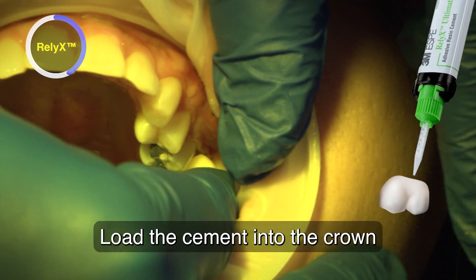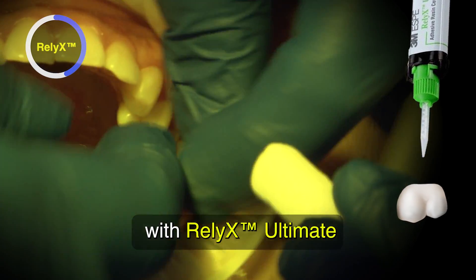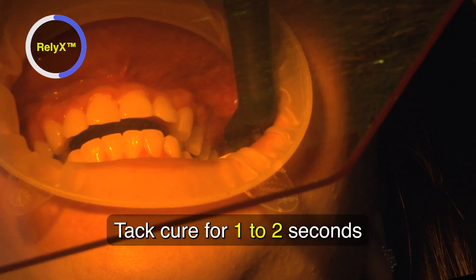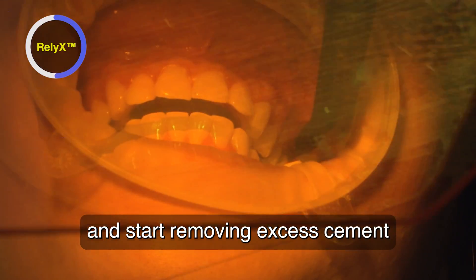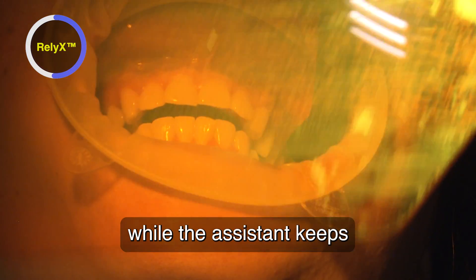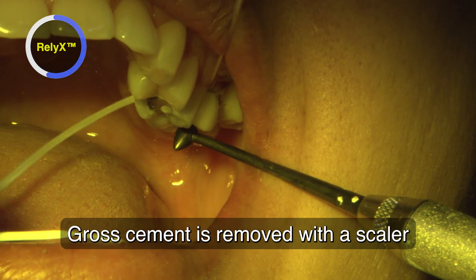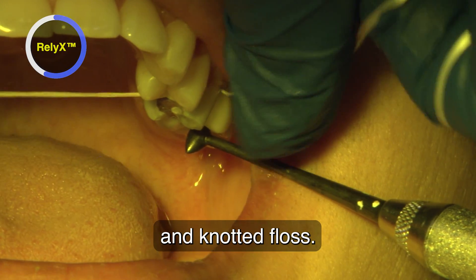Load the cement into the crown with Reliax Ultimate, which is a dual-cure resin cement. Tack cure for 1-2 seconds to achieve a gel state and start removing excess cement while the assistant keeps occlusal pressure onto the crown. Gross cement is removed with a scaler and knotted floss.